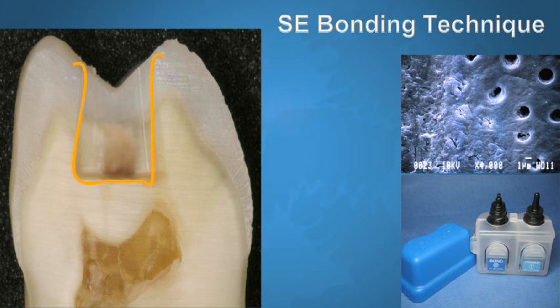It's very important. Manufacturers usually say, hey, blow air for 3 seconds. 3 seconds is never enough. The only way that you're going to be sure that you got rid of the solvent is visual confirmation. You're going to apply a medium stream of air, and you need to see that when it's wet, the liquid moves. By the time you're done drying, you should not see the liquid move anymore. It should be still.